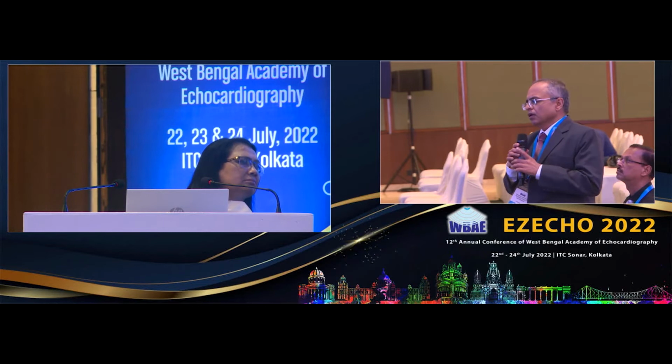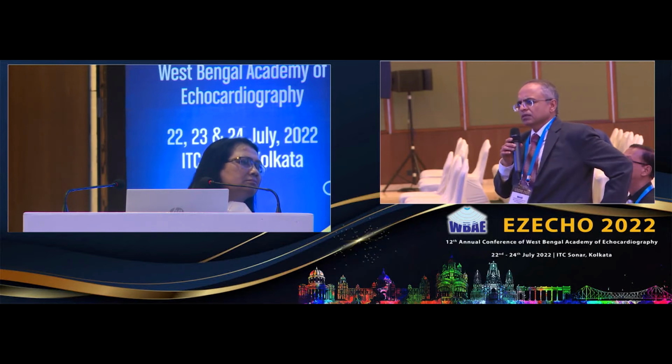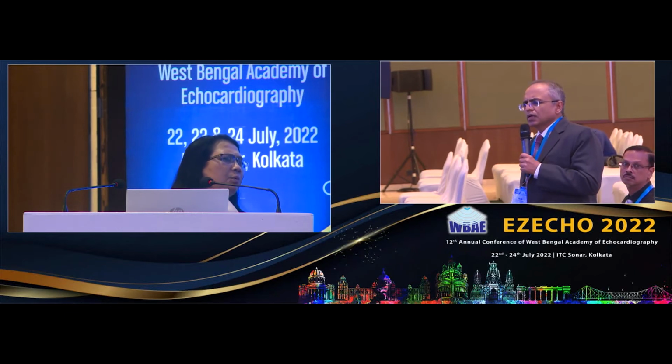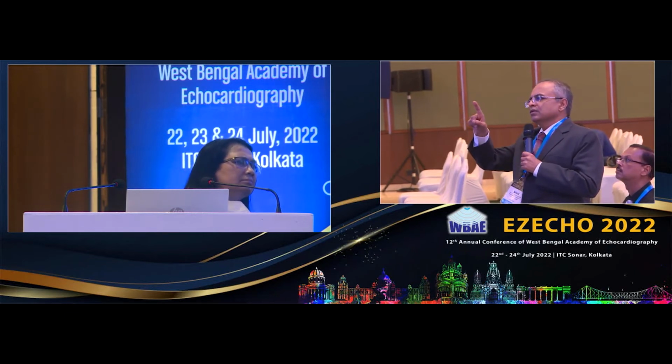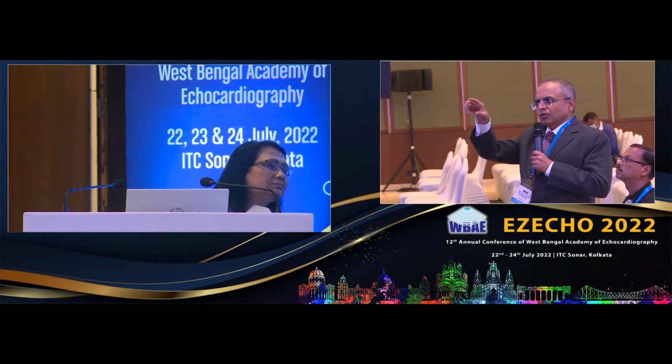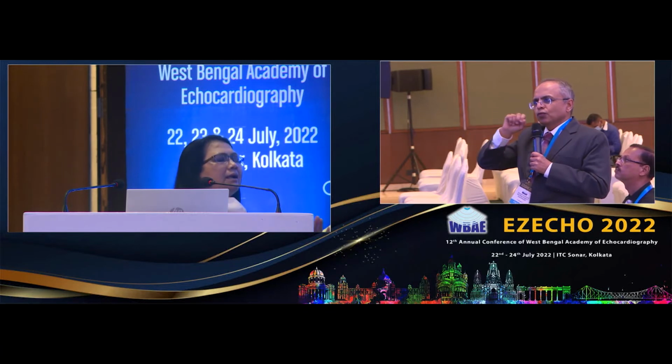But I think the contrast was quite reliable. I mean, we could see the microvascular obstruction in such cases. Correct. The only thing I would advise you is that you go for triggered imaging. You have a continuous imaging for the microvascular perfusion.